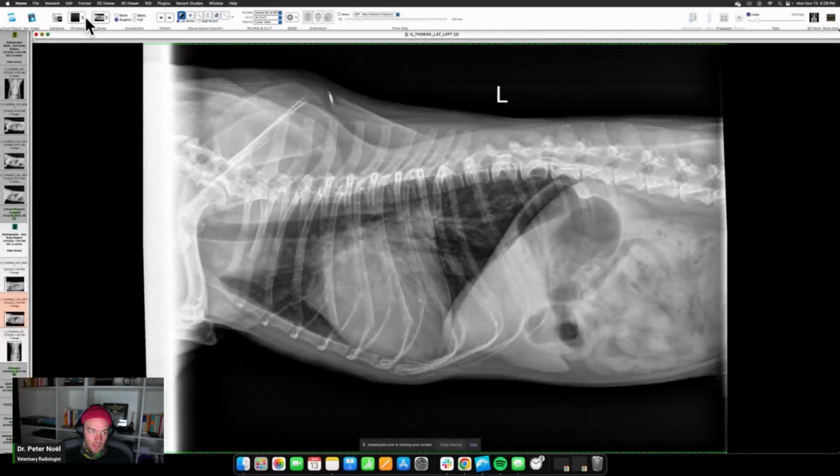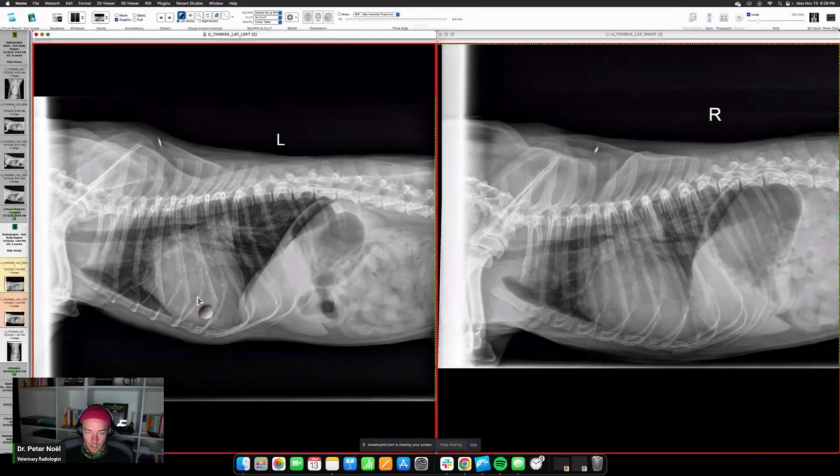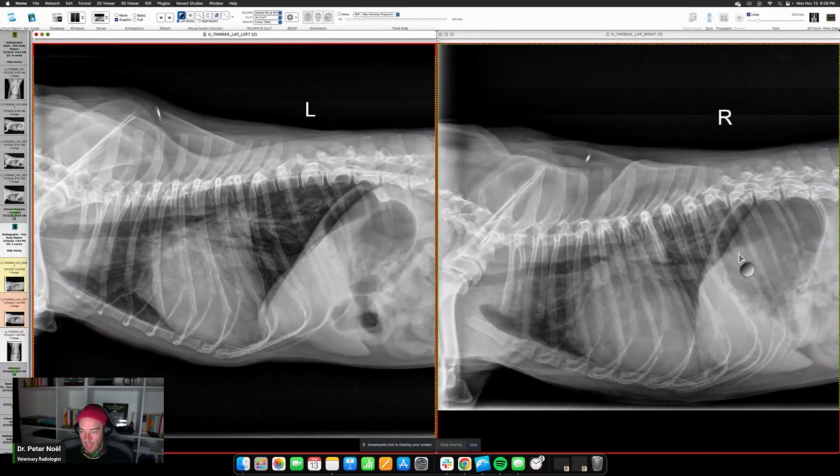It's really great to compare those side by side, because once you compare these side to side, look how more opaque it looks back here relative to there. And yes, some of that is from pathology in the lung, which I'll explain in a second. But a lot of this is from a lack of gas. The animal breathes in gas. It's black like my soul. It fills the lung, and that blackness allows you to then differentiate with anything that's opaque.